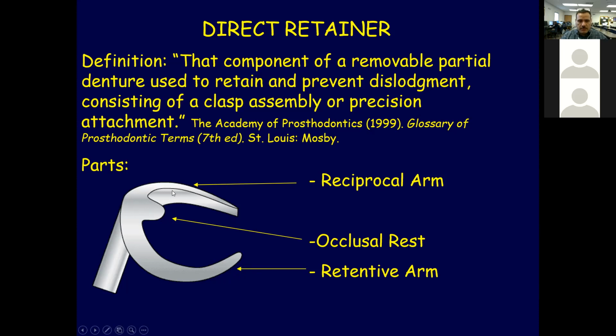Sometimes in the removable, flexible or acrylic partial denture, we replace this metal arm with acrylic. The acrylic will be here, and the partial denture here on this side, or the retentive arm on this side.